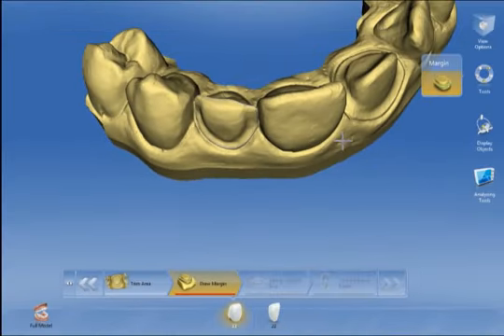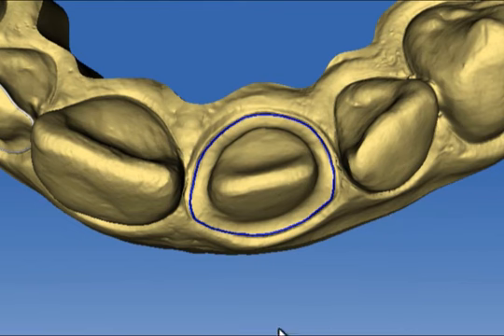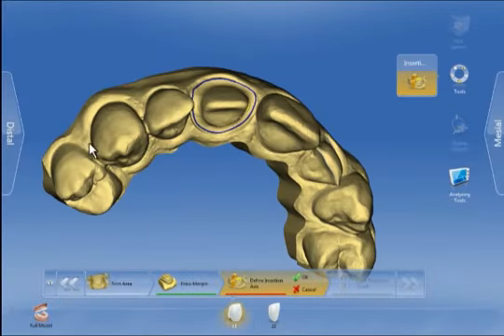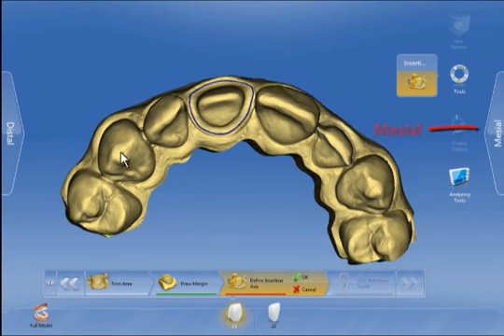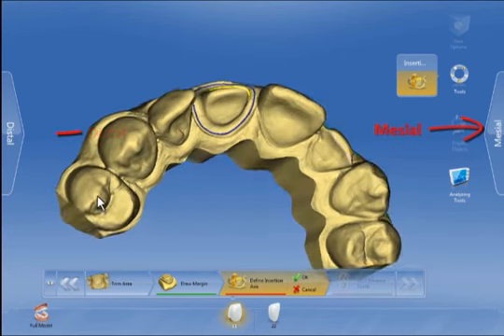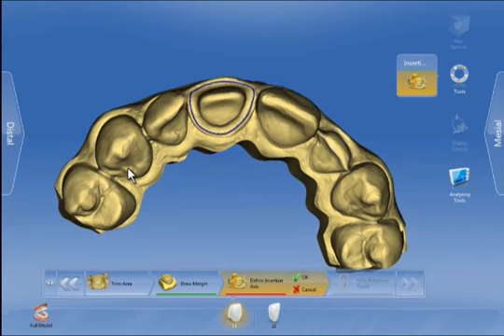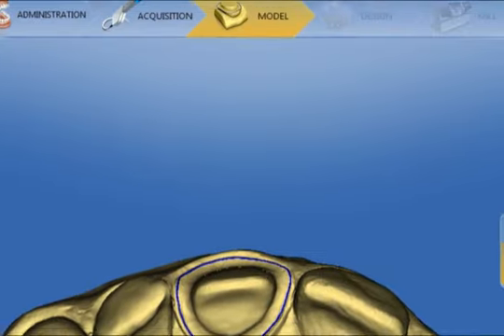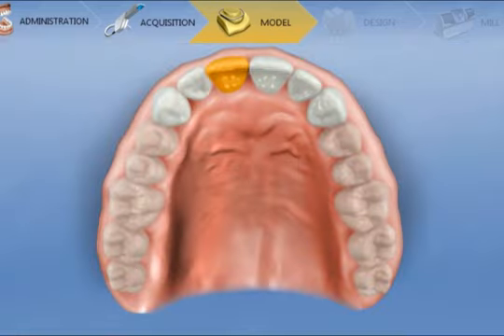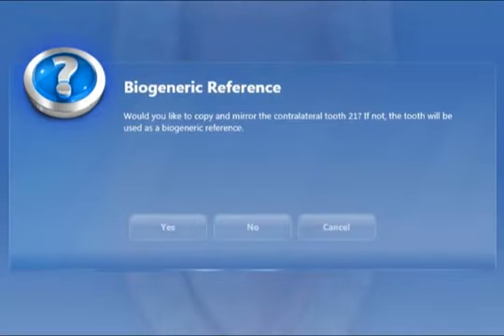Now we activate tooth 1-1 and enter the preparation margin for the full crown 1-1. Next we define the insertion axis with mesial on the right and distal on the left, with preferably no yellow undercut showing. We confirm this and select the reference tooth for the software to use as a data source — in our case, tooth 2-1.